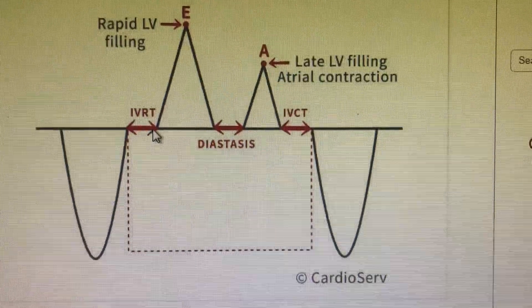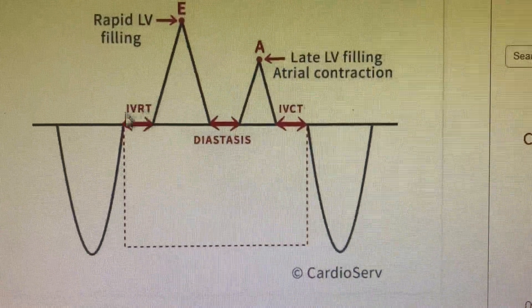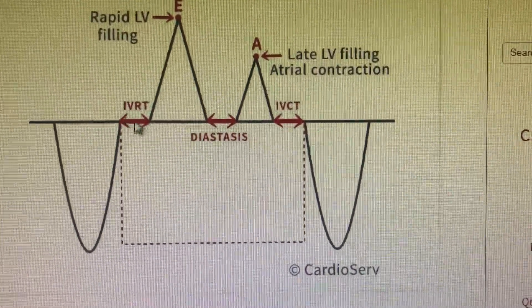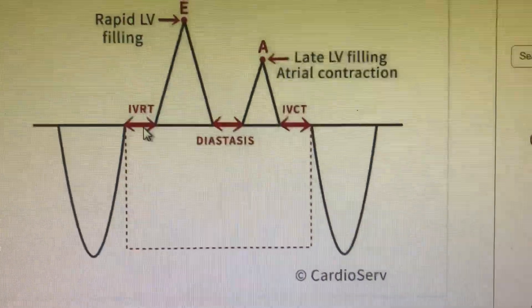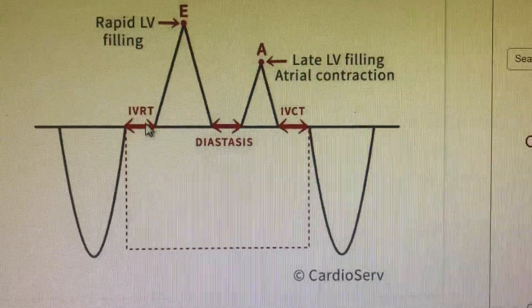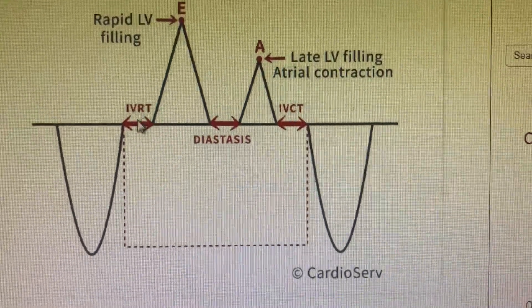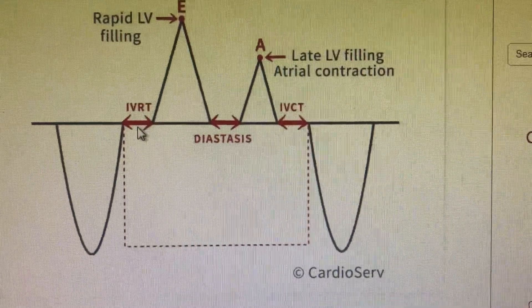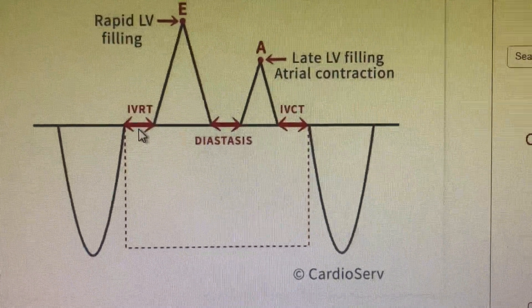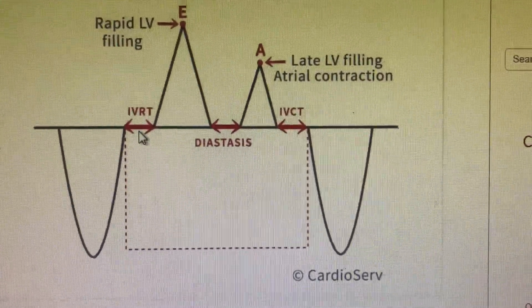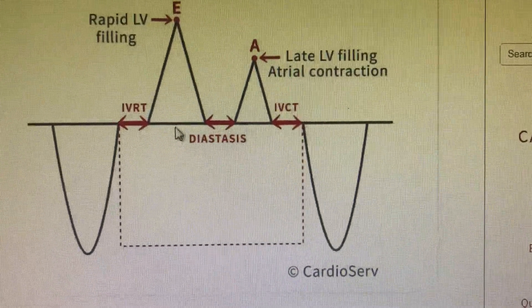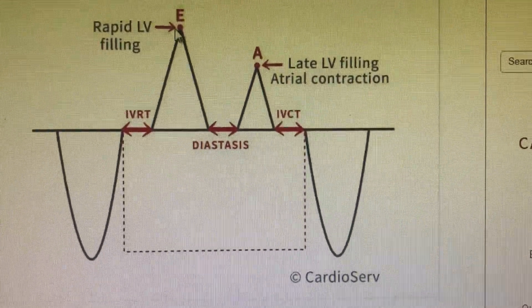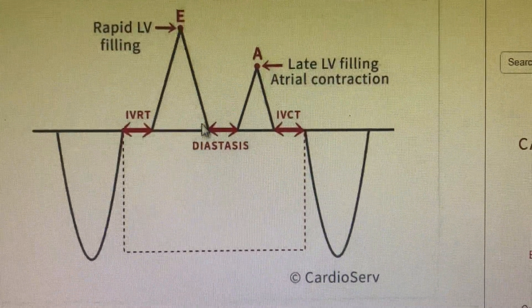Now comes the isovolumetric relaxation time (IVRT), which is also very important. If the IVRT is very much less than normal, we are most probably dealing with diastolic dysfunction.